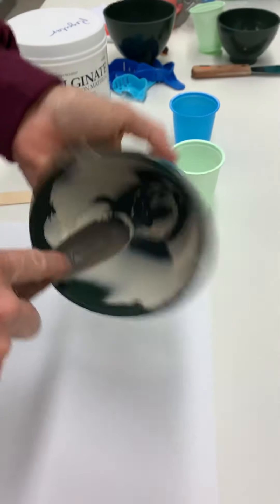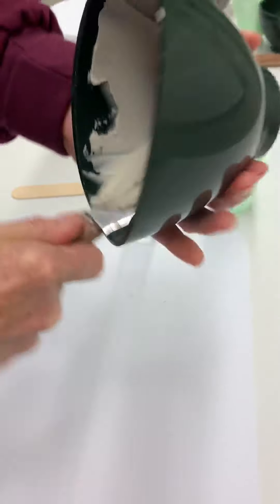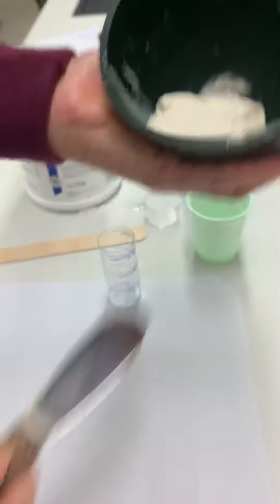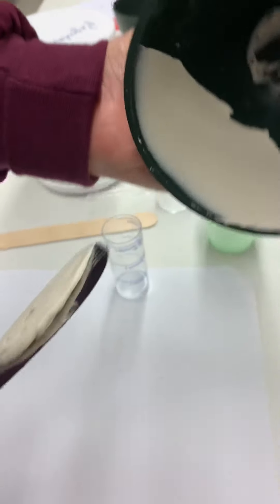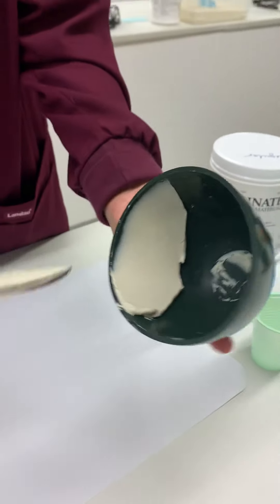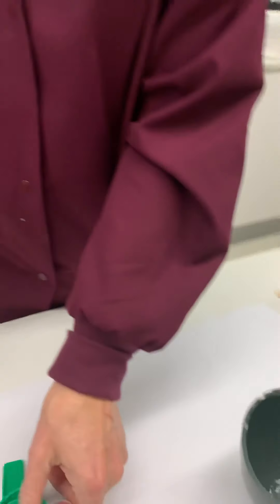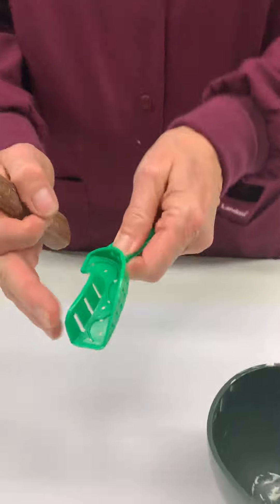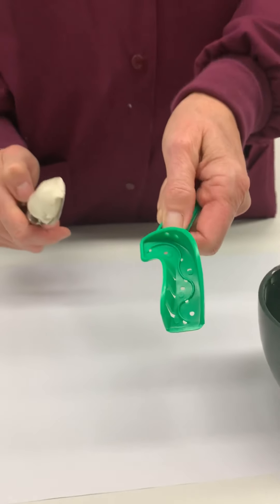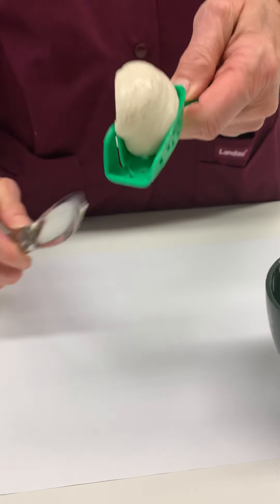Our consistency for our alginate should be smooth. I'm gathering up the material and checking it — we want a nice smooth consistency. Now we're ready to load. I'm going to gather up all of the material and go to the inside, which is called the lingual of our quadrant tray, and in one motion go down just like that.